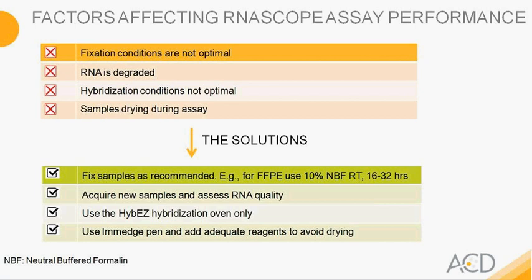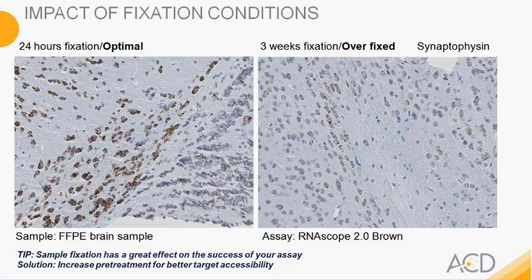You should also pay attention to how you add your reagents to avoid drying. The amount of reagents we recommend to hold through the optimization and washes is very key to the success of your assay. Do not add less reagents throughout the assay since you will see drying.